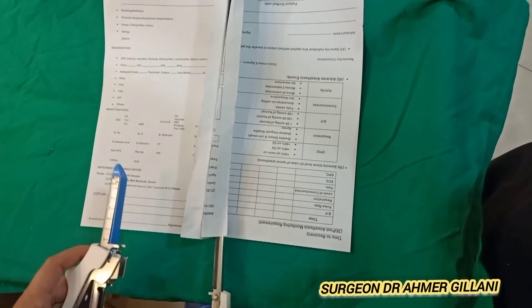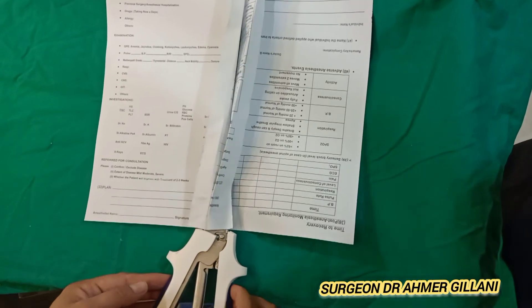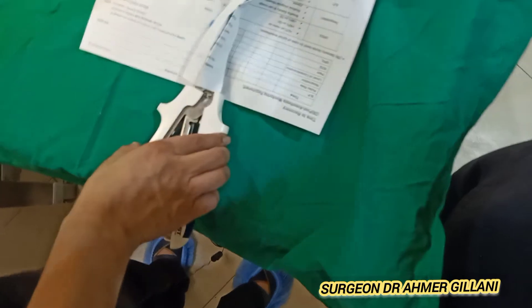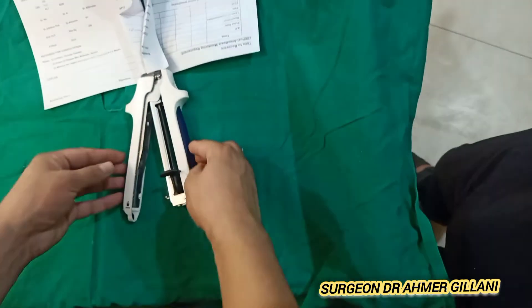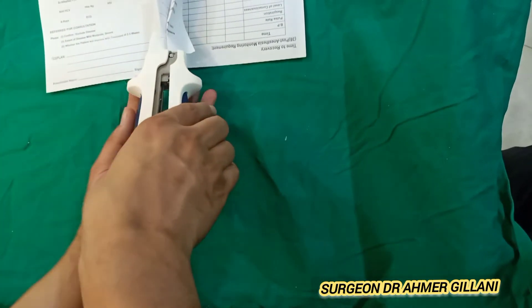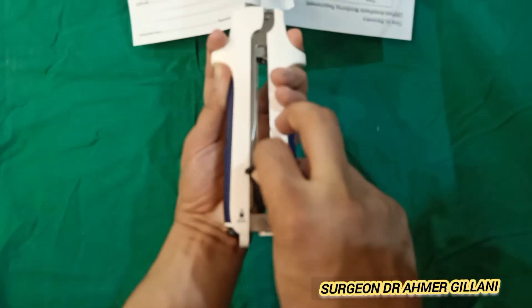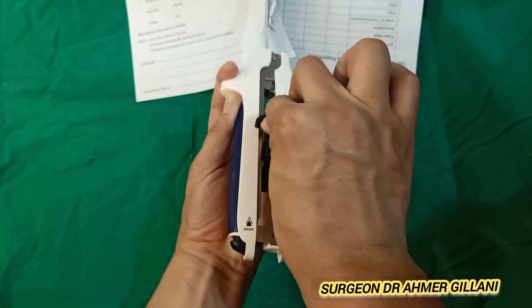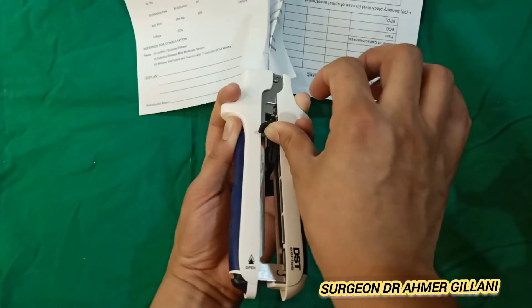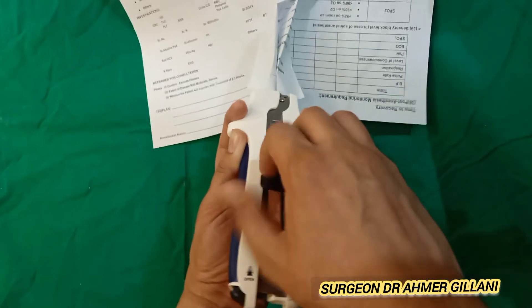First you will put one loop of the intestine here and another loop of the intestine here. After that you will lock it. You will hold it with two fingers at the front and two fingers at the back. Then you will move this button forward, wait for about 10 seconds, and then move it back.